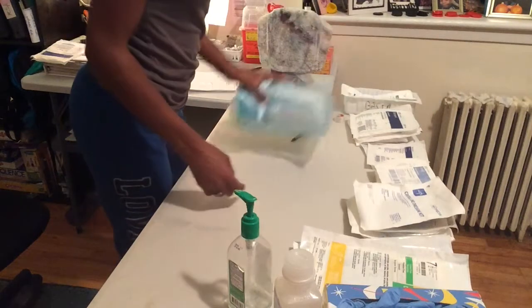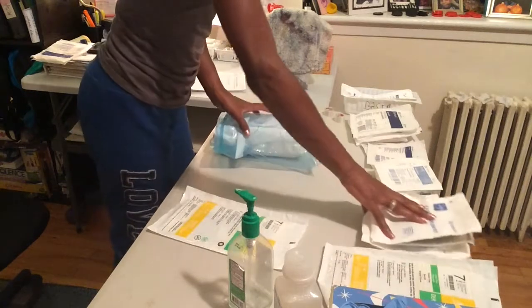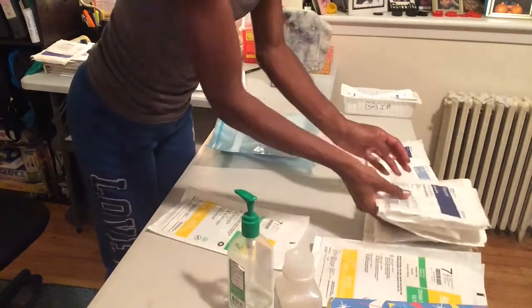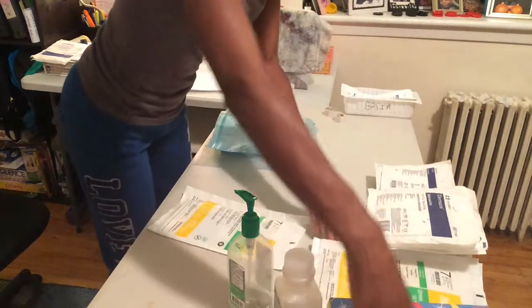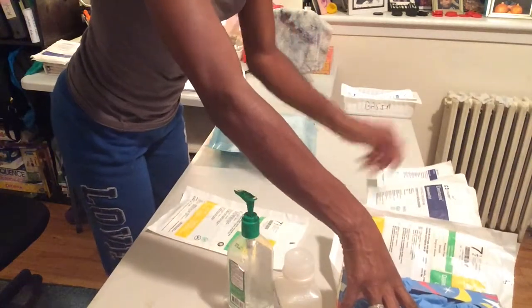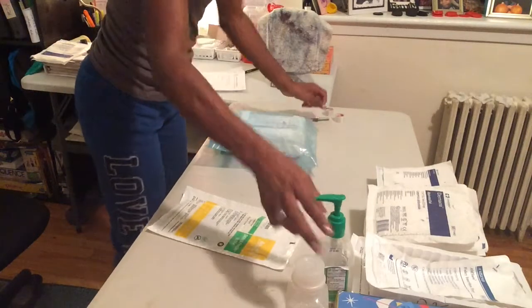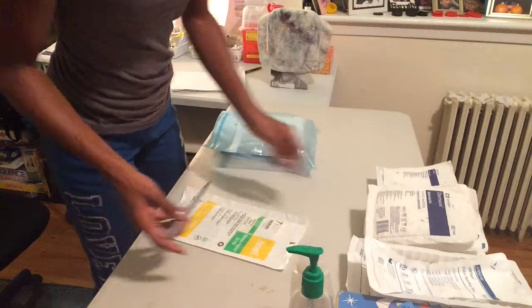Once my supplies are organized I'm going to open them away from me. You can rearrange the area to make it work best for you, and that is what you see me doing here — I'm trying to maximize the space that I have, so I'm rearranging the table.